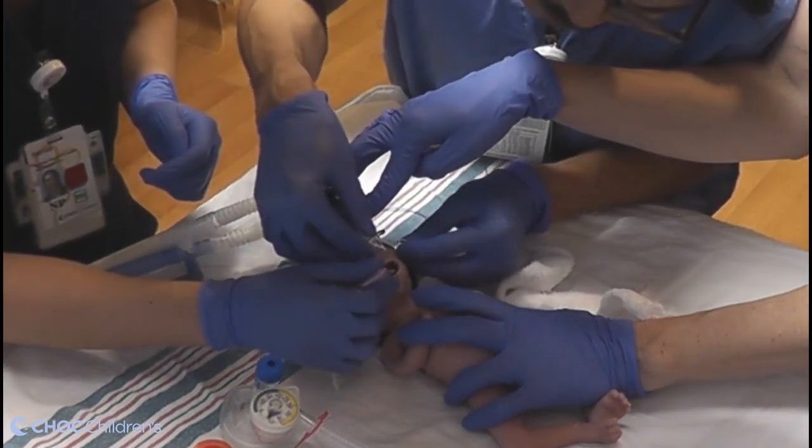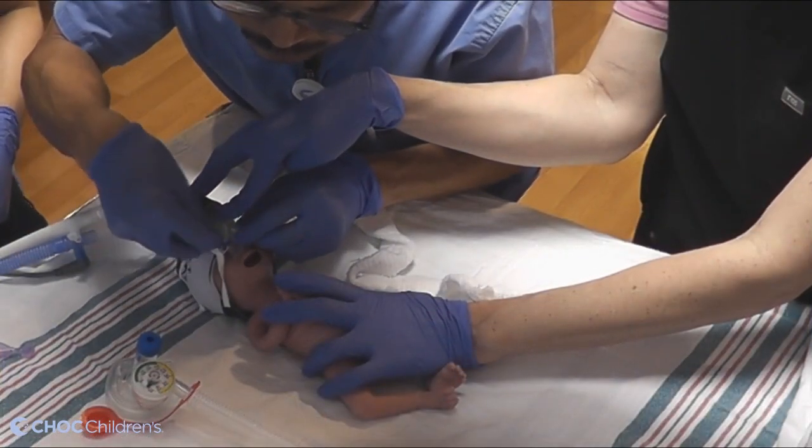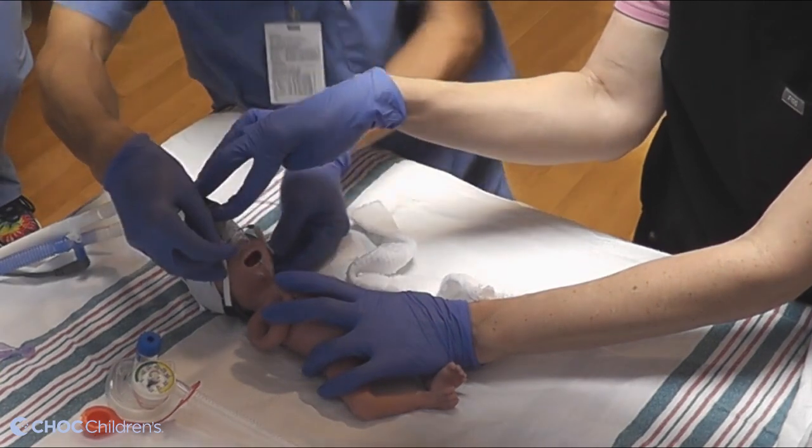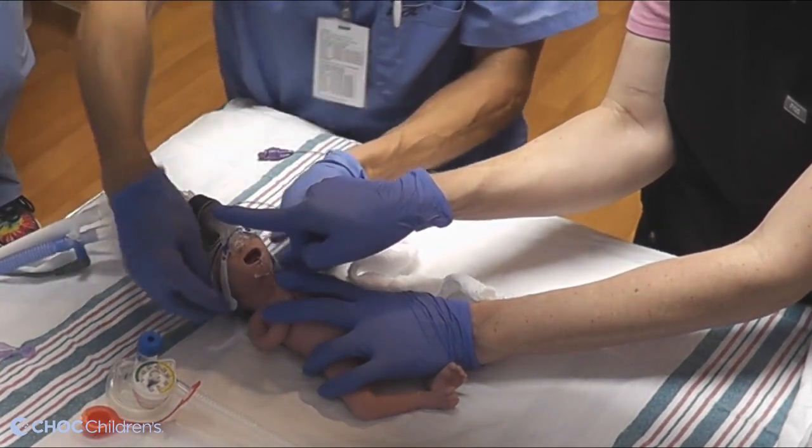Give your sucrose to minimize discomfort. Ensure the bubbling of the CPAP, and you're going to monitor the vital signs by activating the monitor QRS volume on the screen.